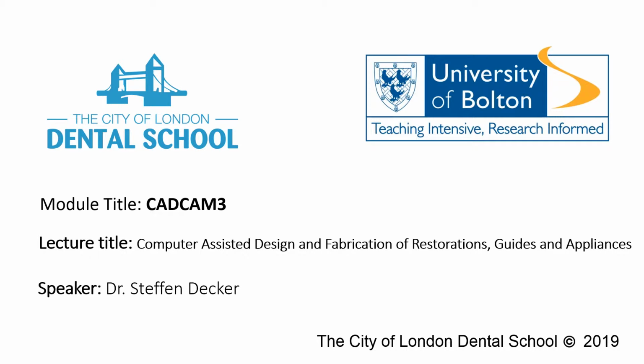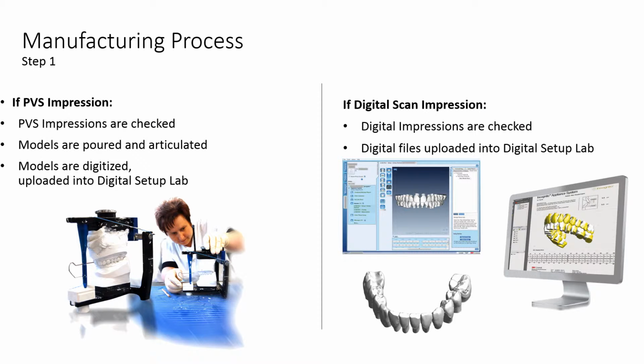Computer Assisted Design. And today we want to talk about my special area, to start off at least: lingual braces, the CAD/CAM design of lingual braces. We talked before about indirect bonding, smile design, and the aligner workflow, but now where it becomes very interesting is the digital and customized fabrication of lingual braces.